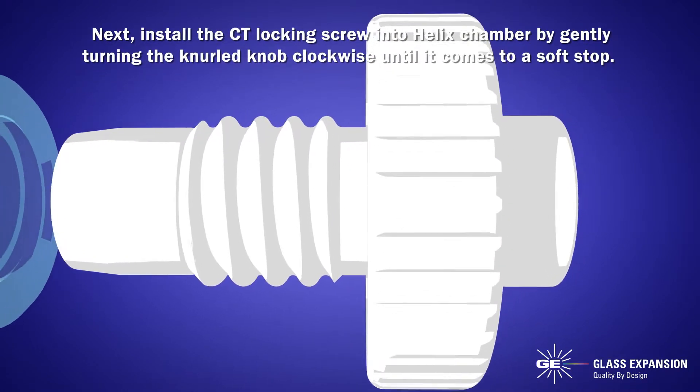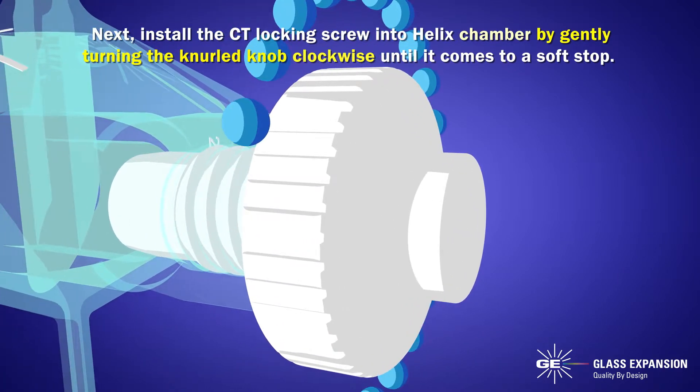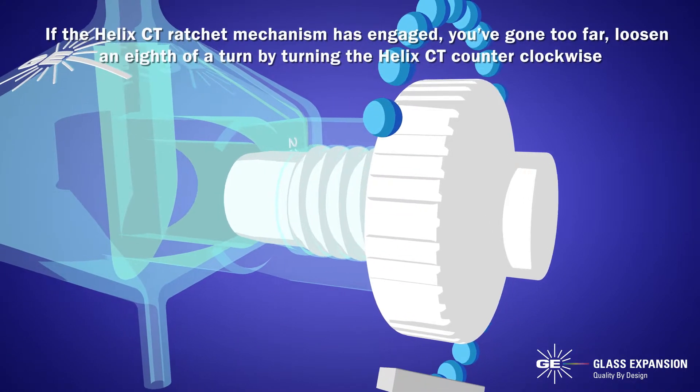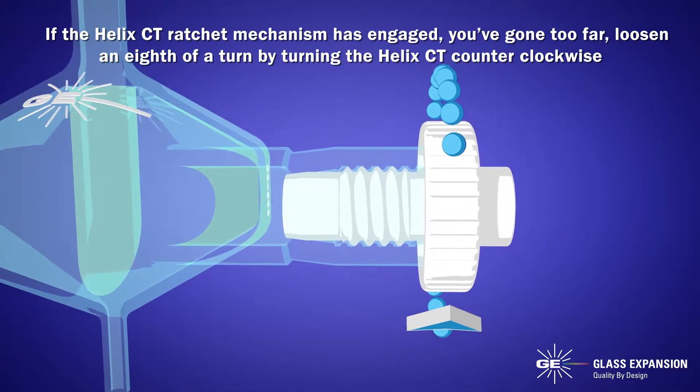Next, install the CT locking screw into the Helix chamber by gently turning the knurled knob clockwise until it comes to a soft stop. If the Helix CT ratchet mechanism has engaged, you've gone too far. Loosen an eighth of a turn by turning the Helix CT counterclockwise.